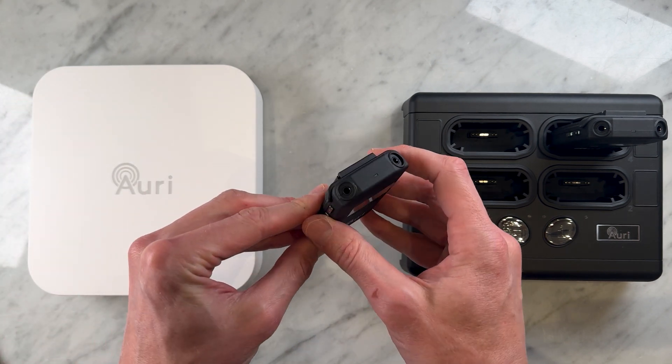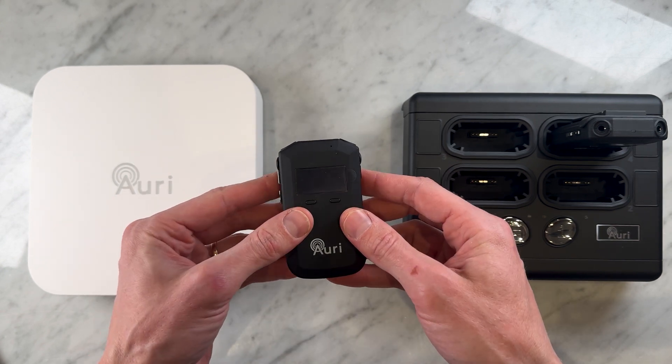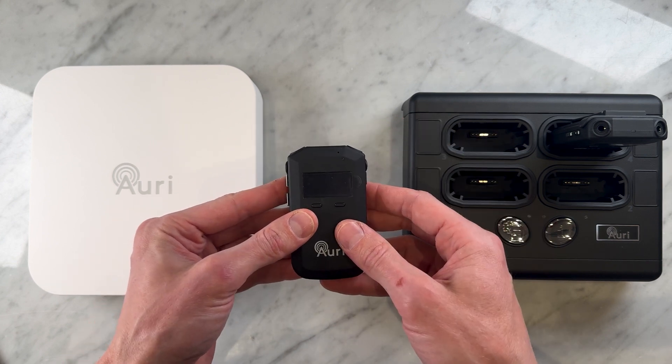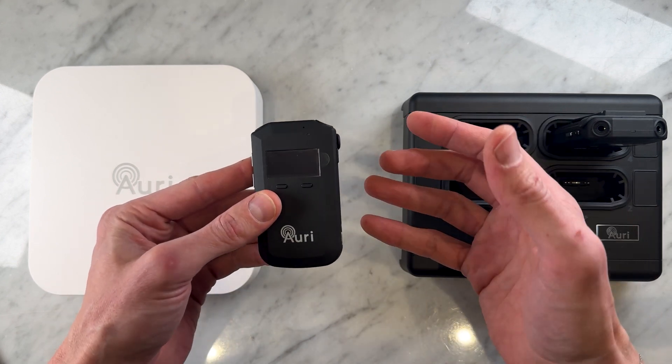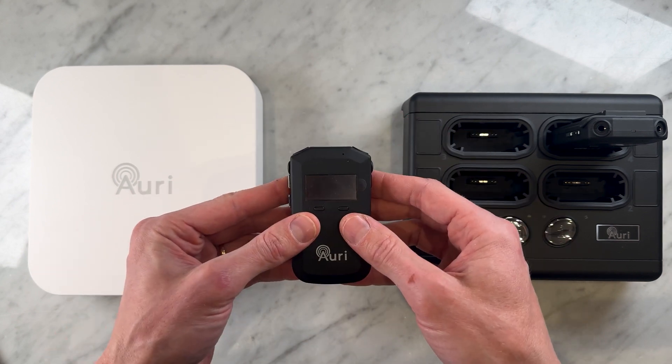You'll notice here that the RX1 is equipped with two 3.5mm TRRS jacks compatible with standard headphones and an inductive neck loop. So they can cater for those of you wearing non-Auracost-ready hearing aids with a built-in telecoil.